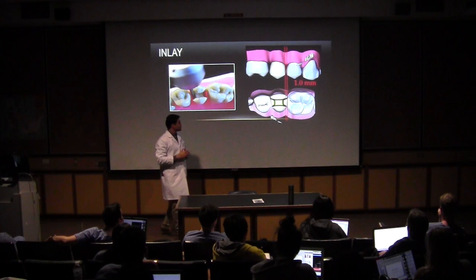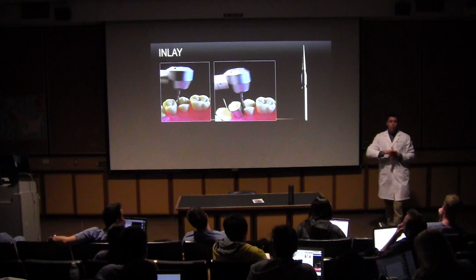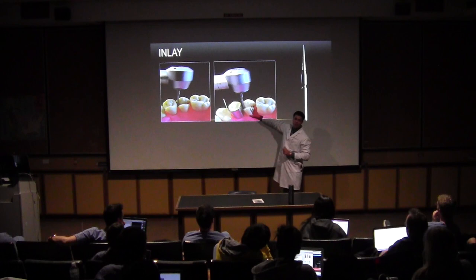So after working on the clearance, we are going to smooth the line angles with the needle-shaped diamond point. All the line angles, the axiopulpal angle, we must make it smooth and round, all right? To avoid stress concentration.